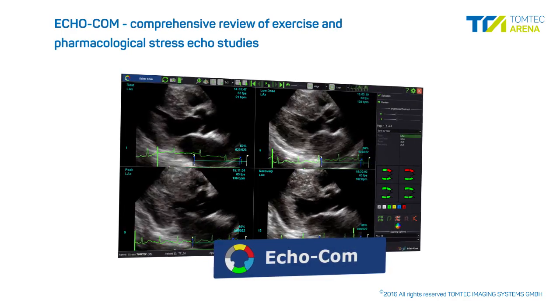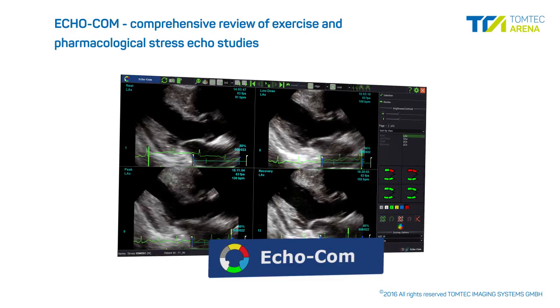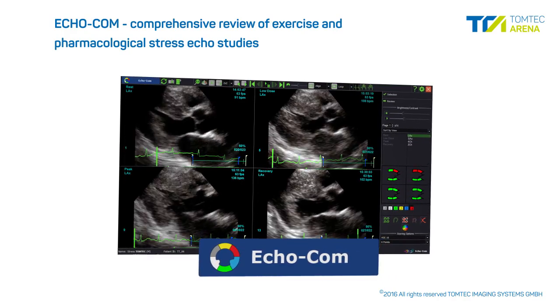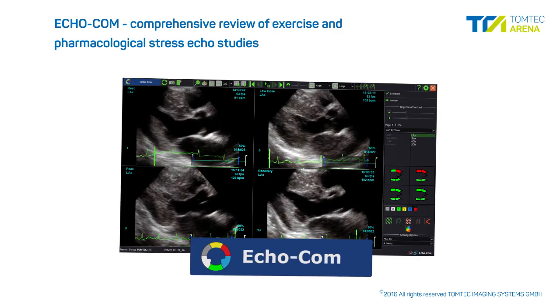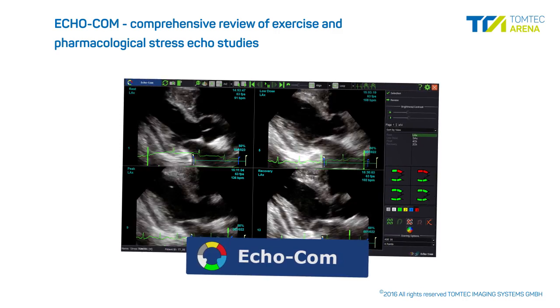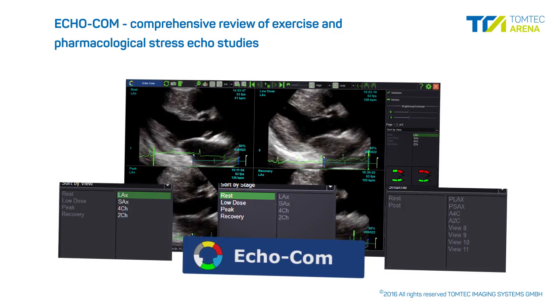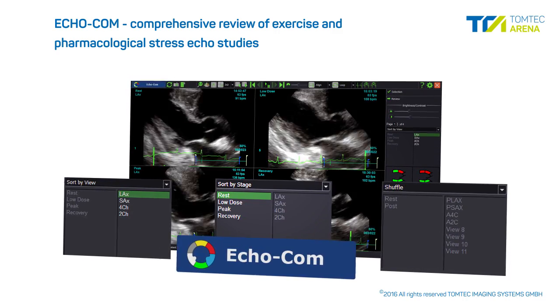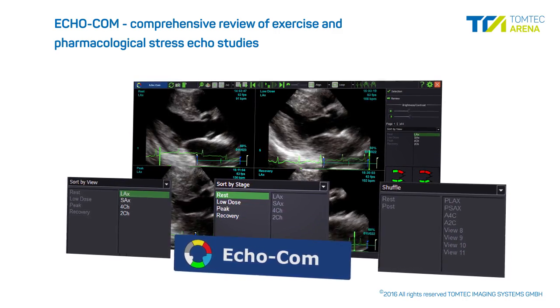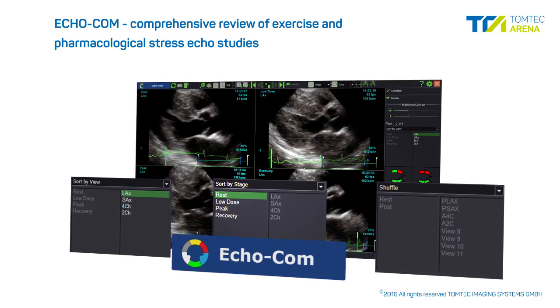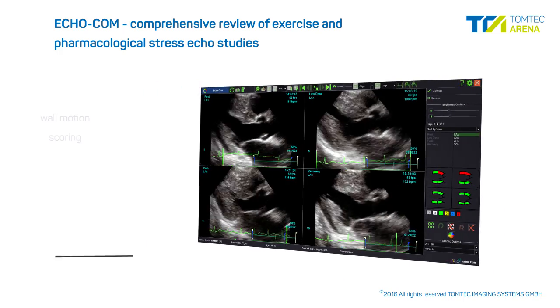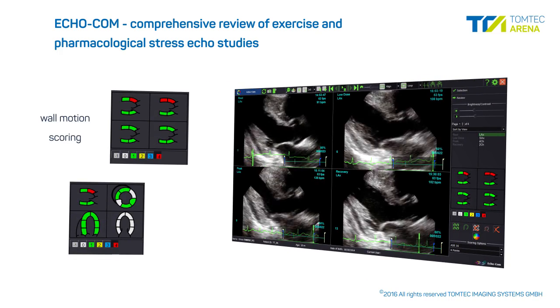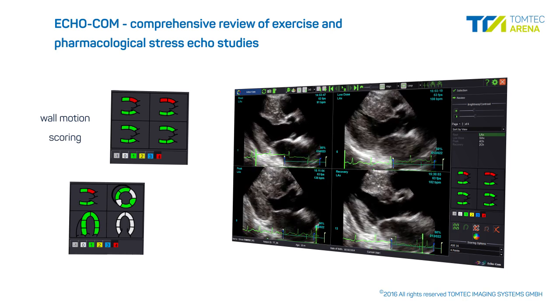ECHO-COM provides a comprehensive review of exercise and pharmacological stress echo studies. Automatically arranged stress echo loops by view or stage and the shuffle mode enable quick and intuitive image review. An easy-to-use wall motion scoring is used to document all findings.